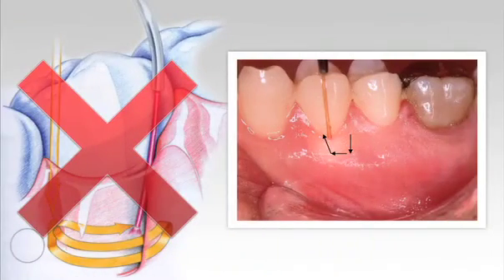When we come to using the diode laser in a periodontal pocket, a gentle stroking action is essential. Some articles in journals suggest putting the tip right down to the base of the pocket and sweeping it sideways many times before withdrawing it, as shown on the left diagram. This method increases the chance of blood or crevicular epithelium interacting with the end of the tip and reducing its output. A better method is shown on the right.